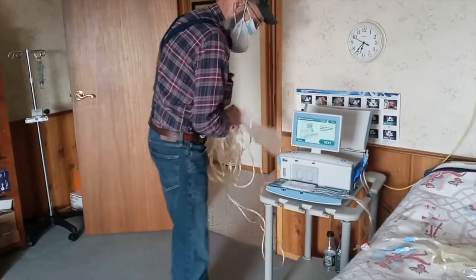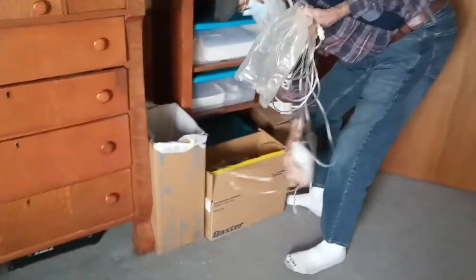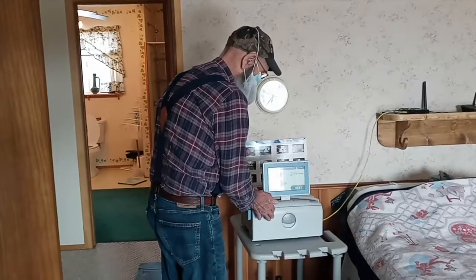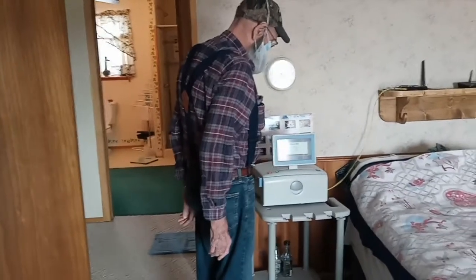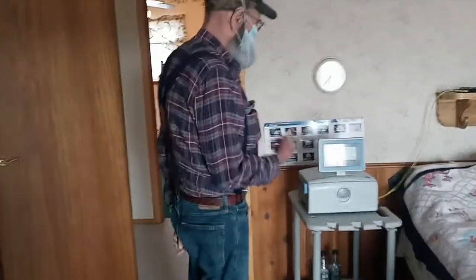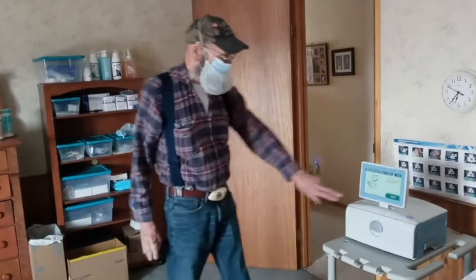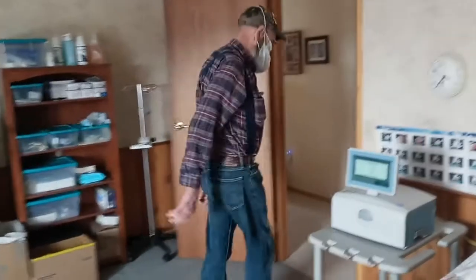Remove and discard the cassette with solution bags and organizer. Close the front door and heater lid. And then, while we wait on this thing to get ready to shut down, we'll go in there and dump that fluid down the drain. Now we just touch the off button and that turns off the machine. But it takes a while for it to shut down, so while we're doing that, we'll come in here and get rid of this one.